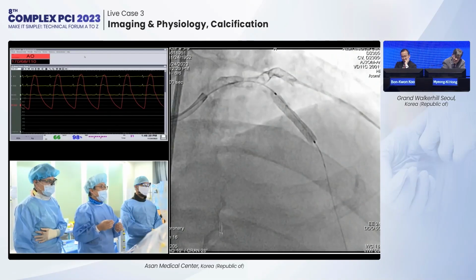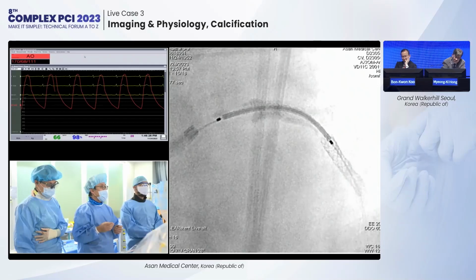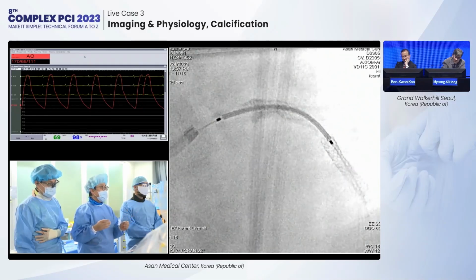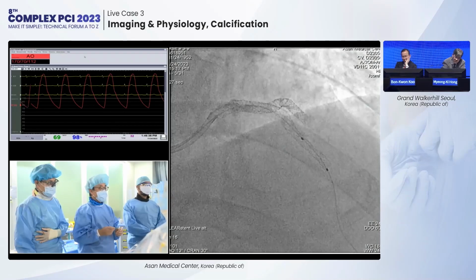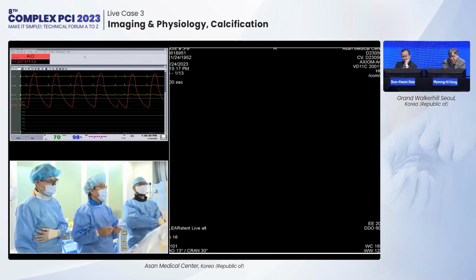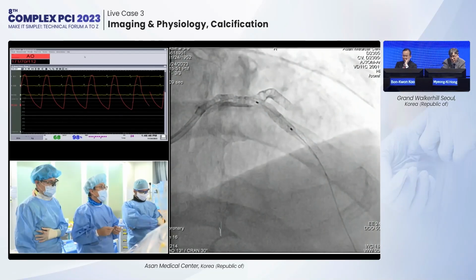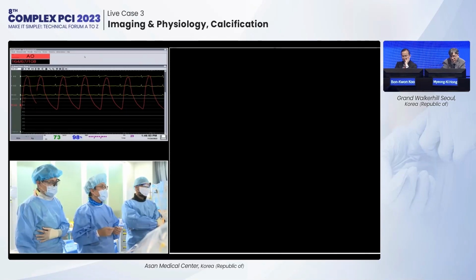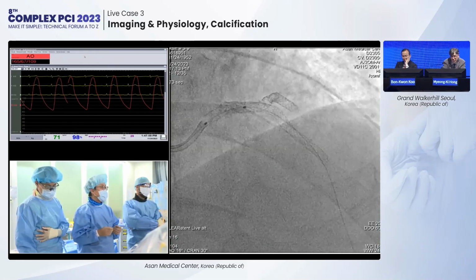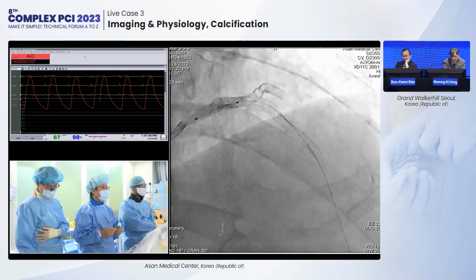We inflated one stent and the middle part. Next, we tried to match the overlapping stent zone and inflated. So we did a very aggressive NC balloon dilation using 3.0, then 3.5, and 3.5 again. Then we tried to match, and we inflated up to 30 ATM using 3.5.